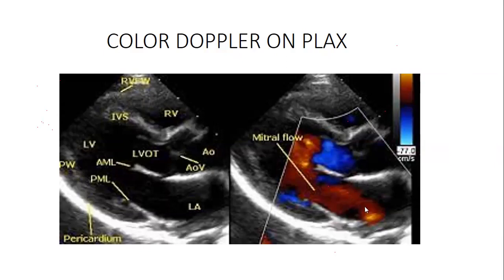That's the left atrium. Thank you. This is the left atrium. Thank you so much. Judith, are you there? Okay, Victoria. It's the left ventricular outflow tract. Yes, left ventricular outflow tract. Yes, there's a reason why I'm asking this. Who else can I pick?